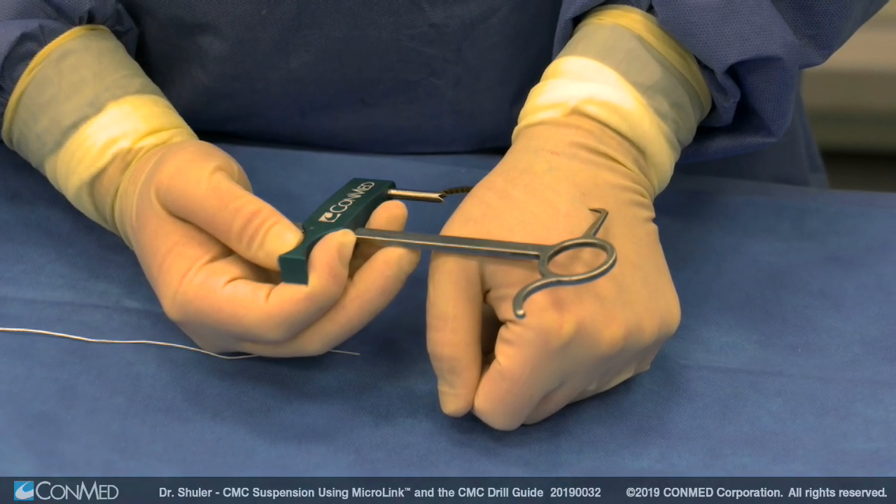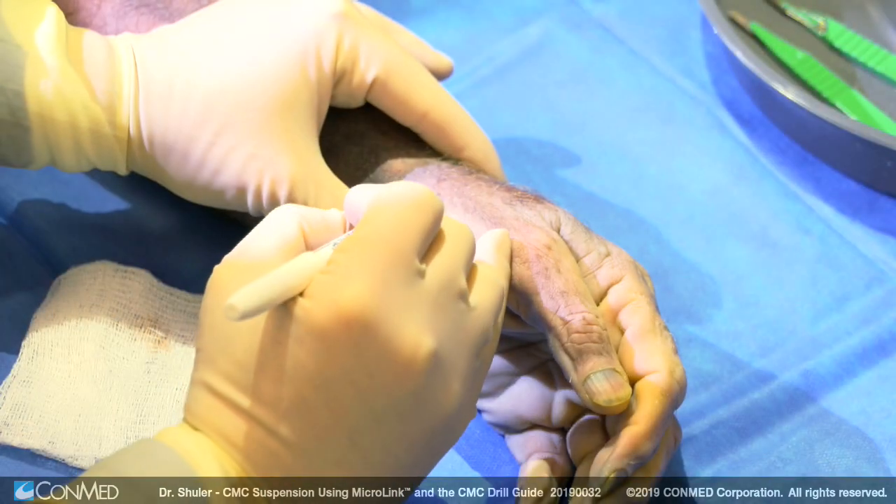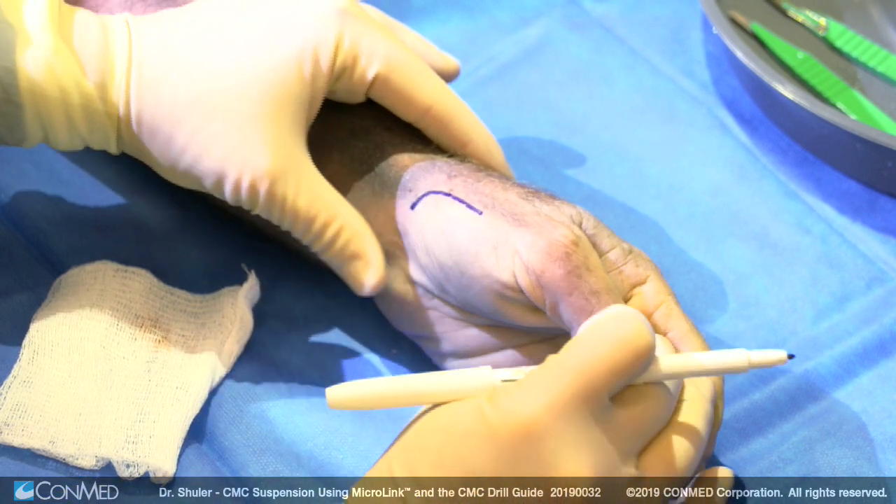The CMC drill guide shown here has the paddle, which is placed at the base of the thumb metacarpal to allow for easier alignment for guide pin placement. Moving on to the surgical procedure.